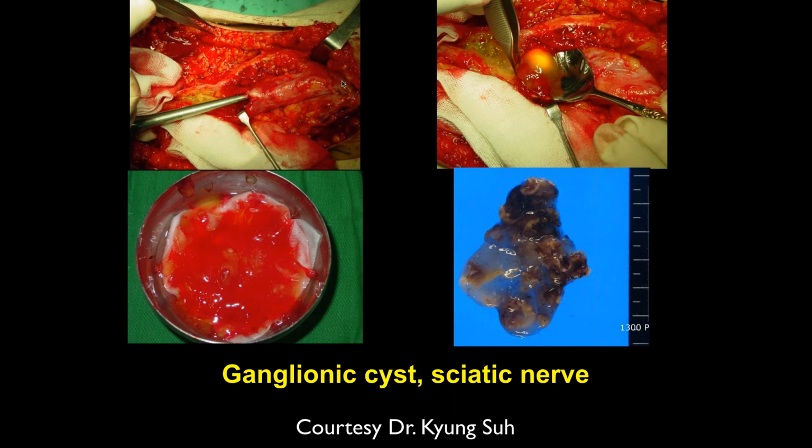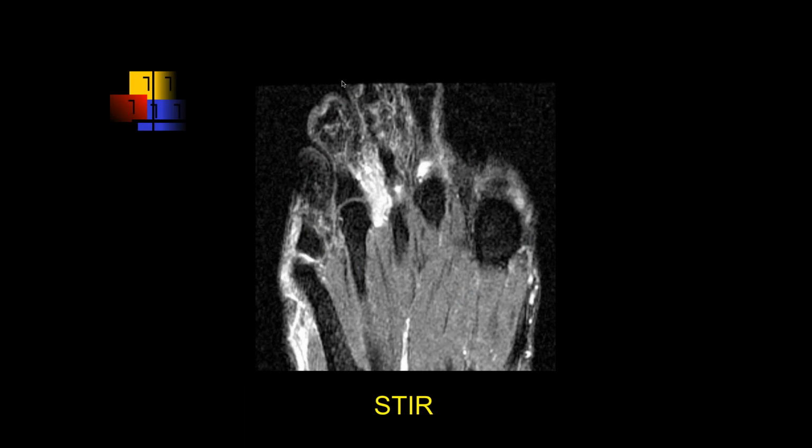There's actually a surgeon at the Mayo Clinic who specializes in these lesions, so it's best to send them to him. But these are cysts. If we got to it, I have several others, and you can actually follow it coming out of the proximal tibiofibular joint space. They've been described rarely elsewhere in the body, but these are ganglion cysts that grow along the nerve. So you only see them around the knee area, I presume? I've seen one other place, but the vast majority have been around the knee. They're rare anywhere, and extremely rare outside of the knee going proximally up the thigh, like that one.